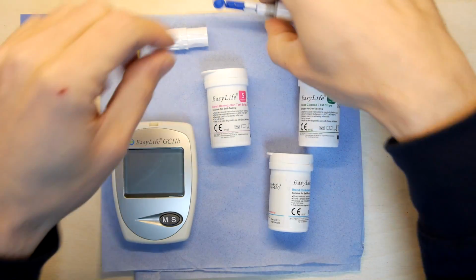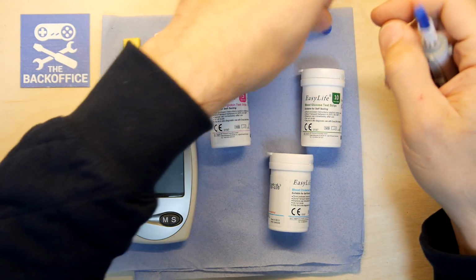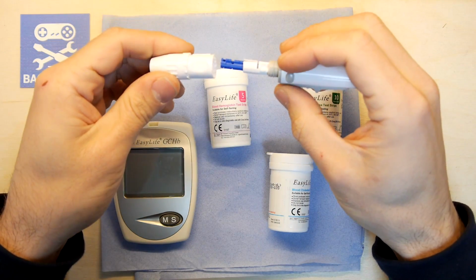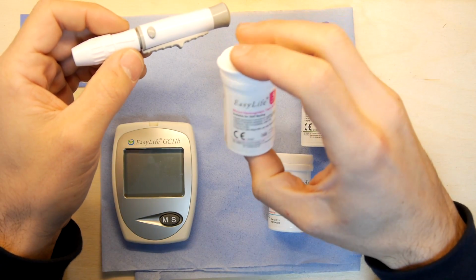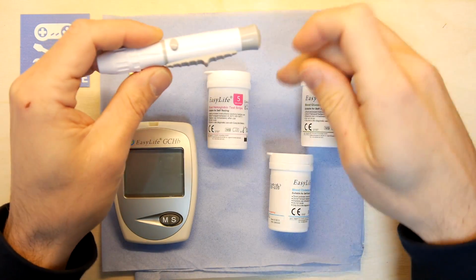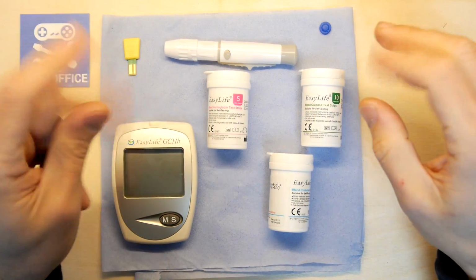So it operates the same as other meters. It does though have an interesting feature in that these boxes have another chip inside. Whereas the older machine I showed you earlier, where I actually had to put in a code that was a number on the vial somewhere, this one actually has a chip that will confirm what's in the vial. So they're all designed so that you don't mess up your test strips and get bad results.